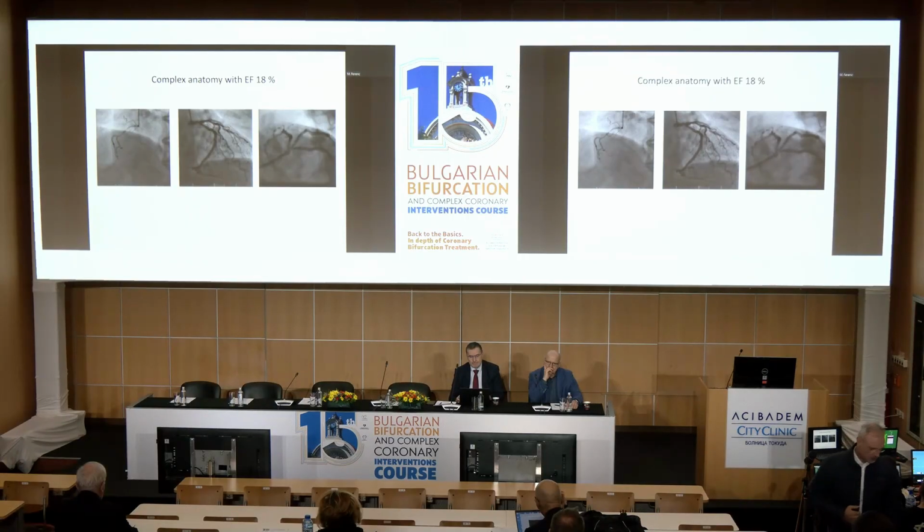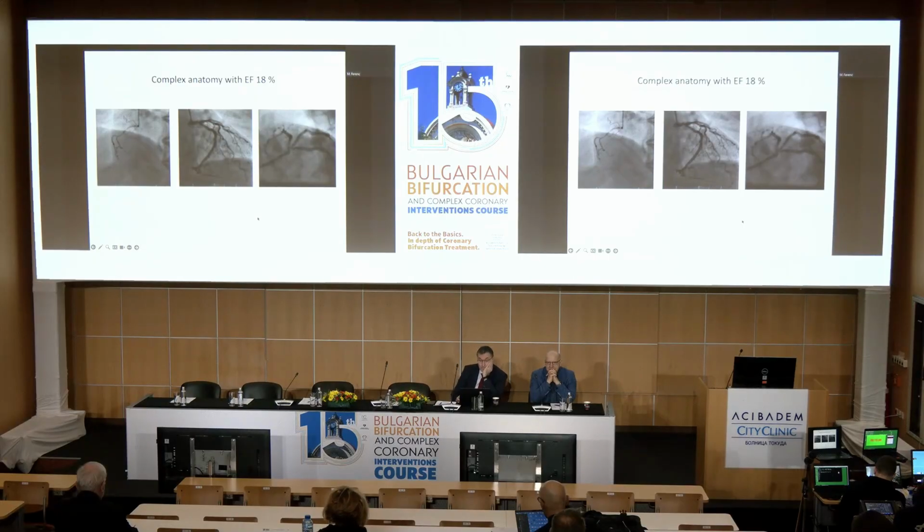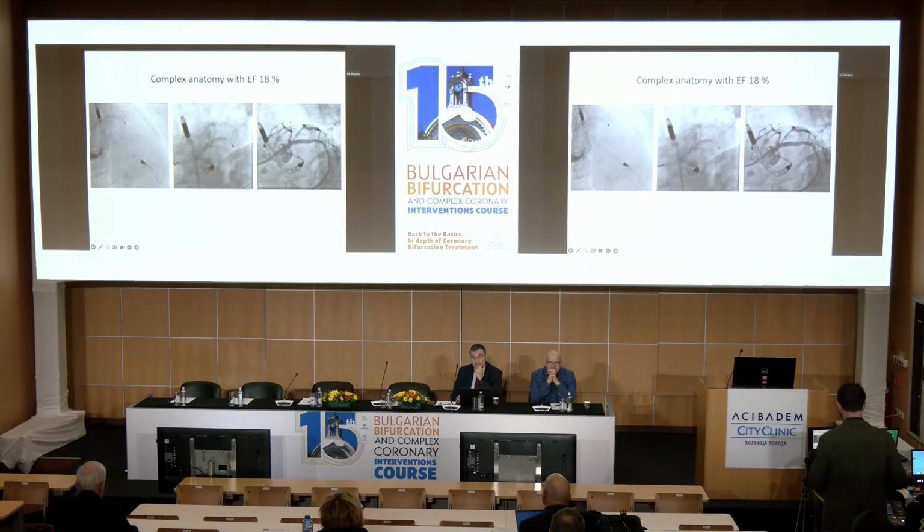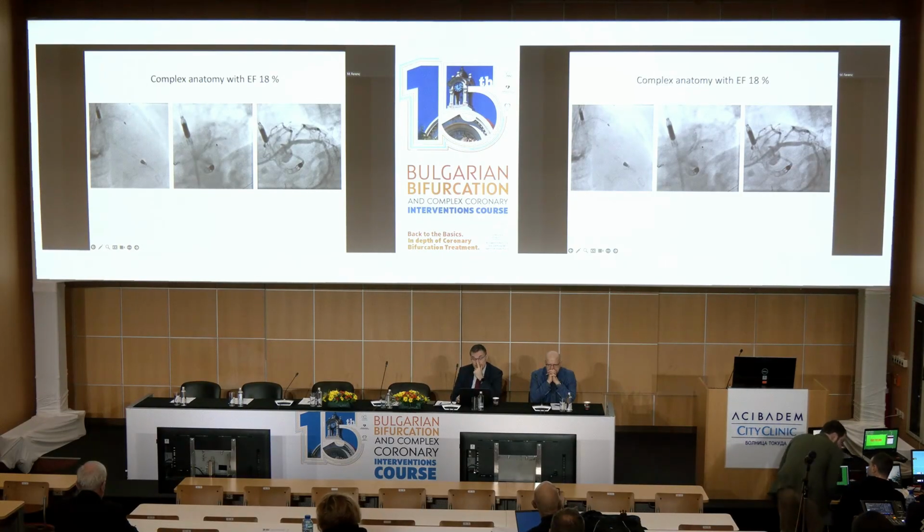What is really very important, if you have such a very calcified distal left main, you see this is nearly a trifurcation, and you have an ejection fraction of 18. That's something you can manage very nicely only if you have hemodynamic protection support with Impella CP. So what we have done, we rotablated to LAD. We could not wire initially to the circ. Then after that, we wired circ, did kissing just to have flow and to stabilize the patient.